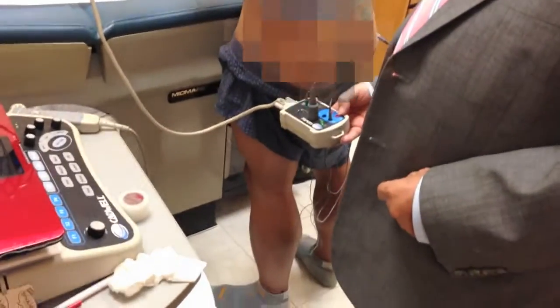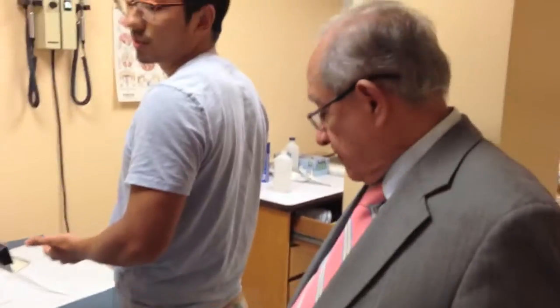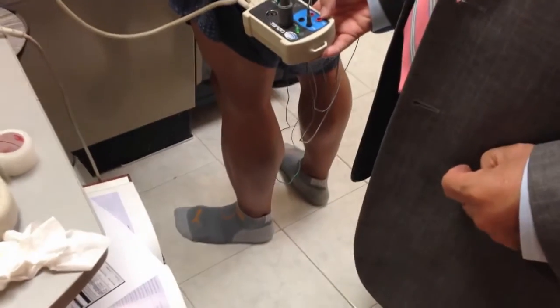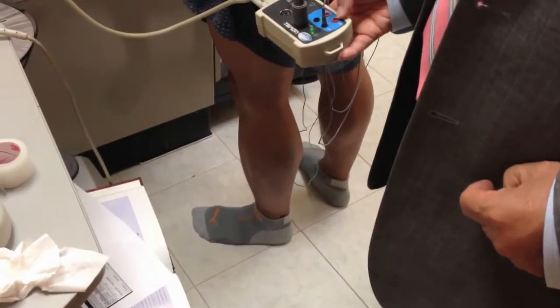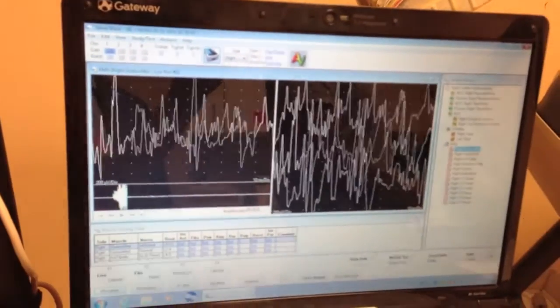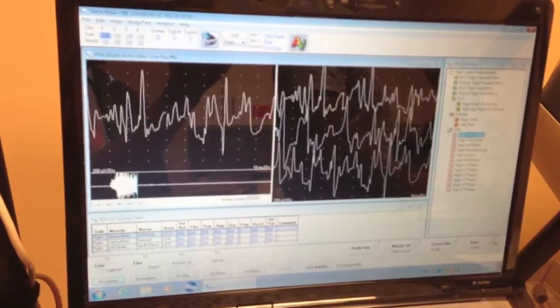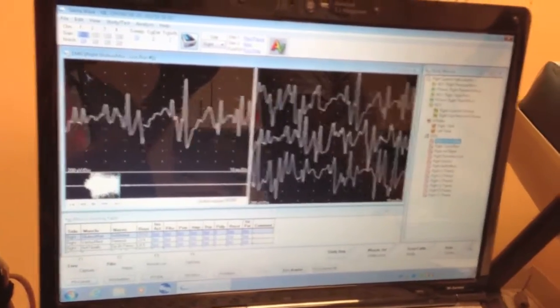I'm trying to show that I can activate the glutes via the feet. I'm just simply standing. Okay, now you can show the wave. Fully engaged. You can show me again.